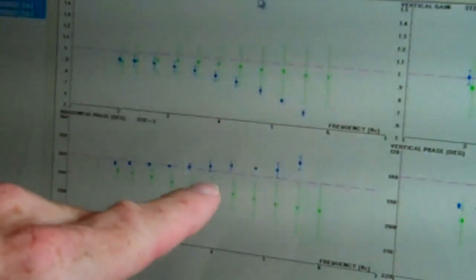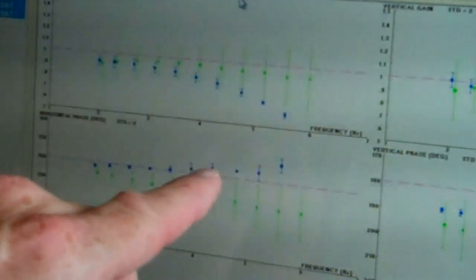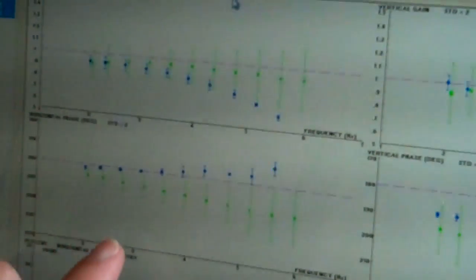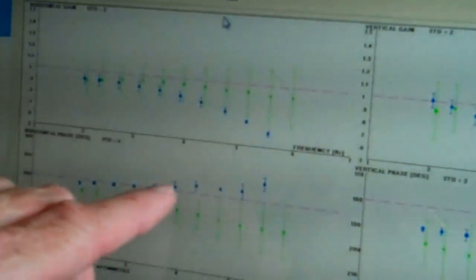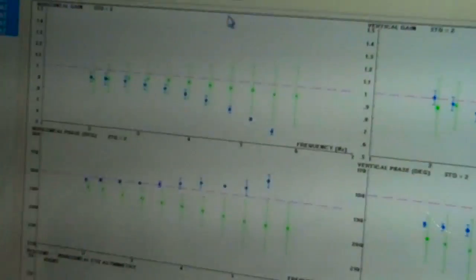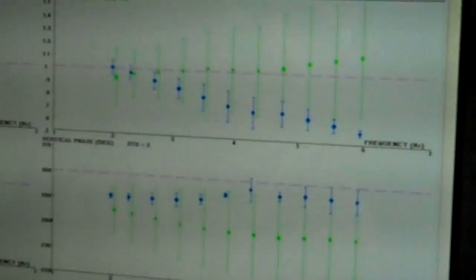As you can see, the green line goes from here to here, and I'm above it. So as I'm moving my head from side to side at about a speed of 3, as I start to speed up, my eye starts to have a little bit of a problem. This can cause dizziness. As you can see, the verticals are pretty much okay. That's the entire test. It takes less than 10 minutes to do.